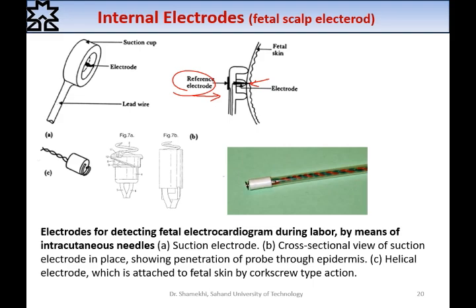and also a helical electrode here, which is attached to fetal skin by corkscrew type action.